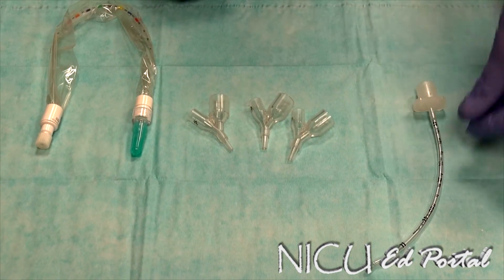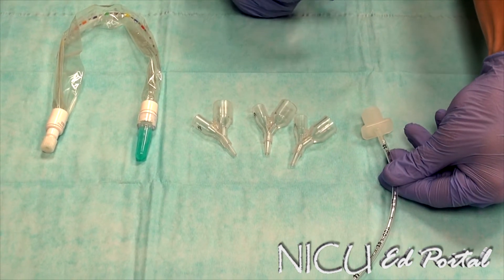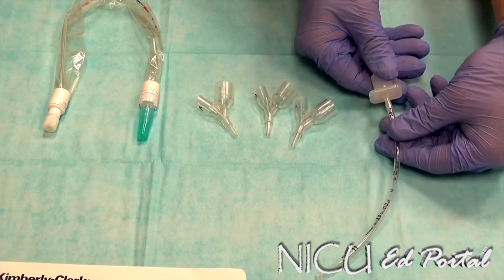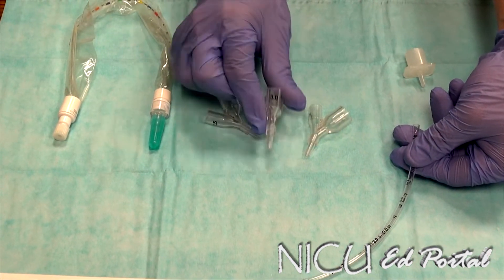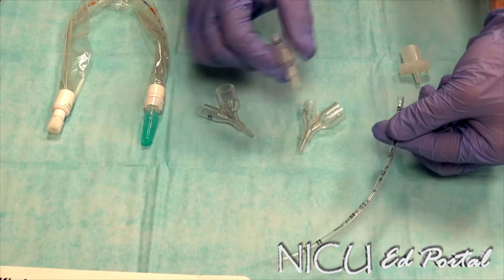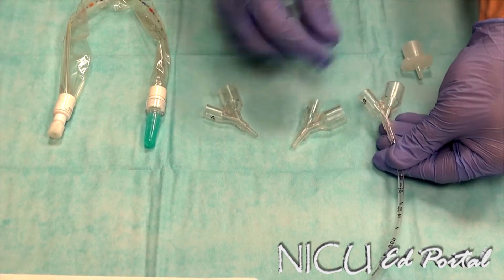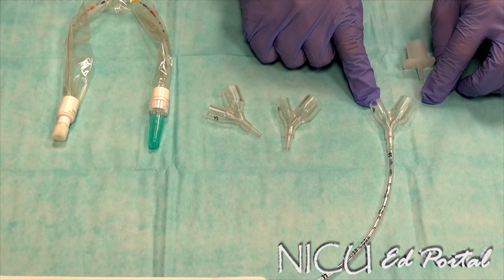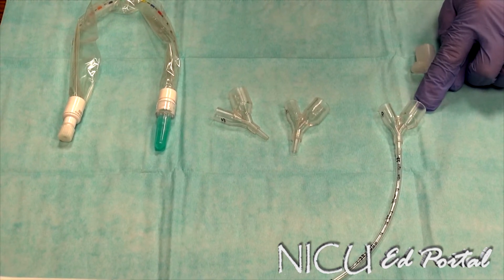For the proper setup, we have a 3.0 ET tube. What we do is remove the stock adapter from the ET tube. You then get the appropriate size surfactant adapter, which is the 3.0. You put that where your original adapter was, and then we have the setup with one port for our catheter and the other port for your manual bag or ventilator circuit.